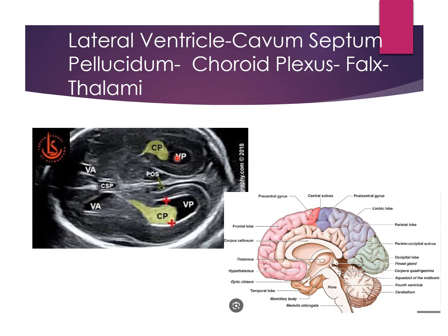We may also see those posterior horn of the lateral ventricle and the choroid plexus, which appear as an echogenic material in that anechoic structure. And the choroid plexus are responsible for production of cerebral spinal fluid. So they kind of all go together, and they're all kind of in the same image. If you take this image in the right spot, you can get all of this anatomy plus your BPD and your head circumference. So keep that in mind. It's not 800 million images. You can really get it in one image.